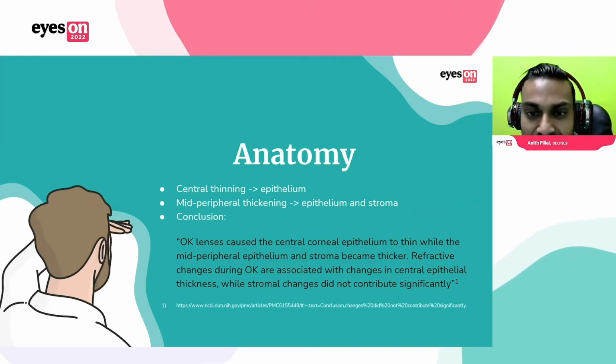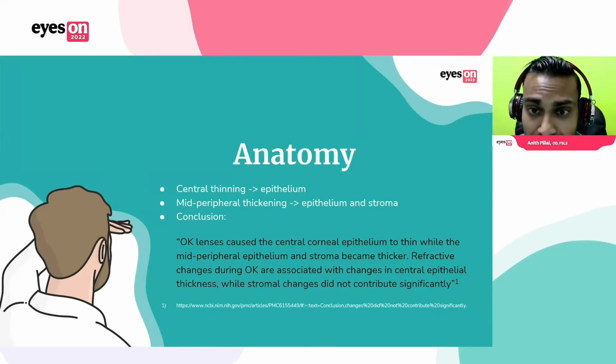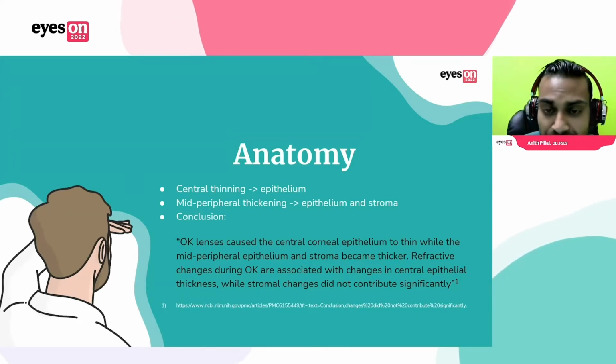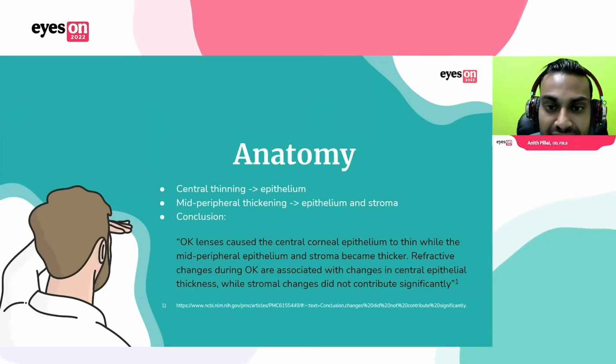All right, almost everything you're doing is an epithelial change. Almost all of the vision correction is due to epithelial changes. And I showed you that on that histology slide where we'll have that central thinning of the cellular layer of the epithelium and that mid-peripheral thickening.